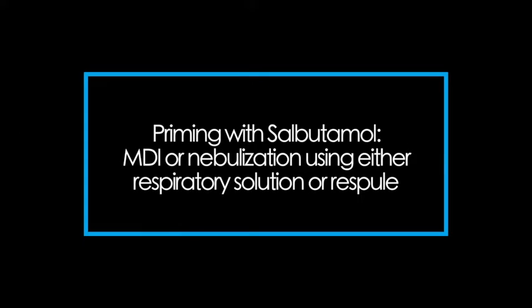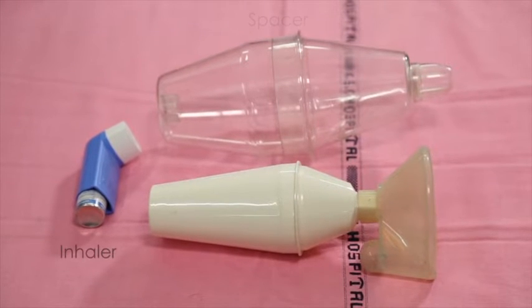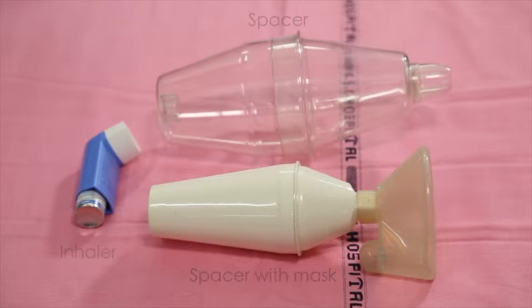Priming with salbutamol can either be done through a metered dose inhaler, that is MDI, or nebulization using either respirator solution or respule. MDI has an advantage that it takes less time and is as effective as nebulization. However, a nebulization facility is essential to give 3% hypertonic saline. Instruments required for this procedure are an inhaler and spacer. A mask is attached to the spacer in case of a young child.